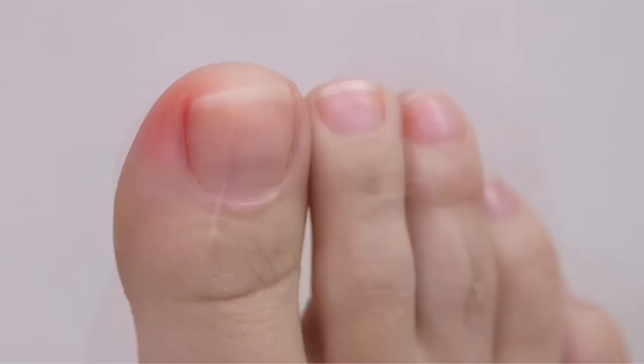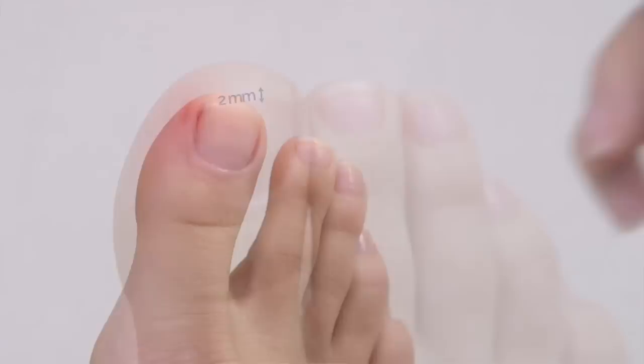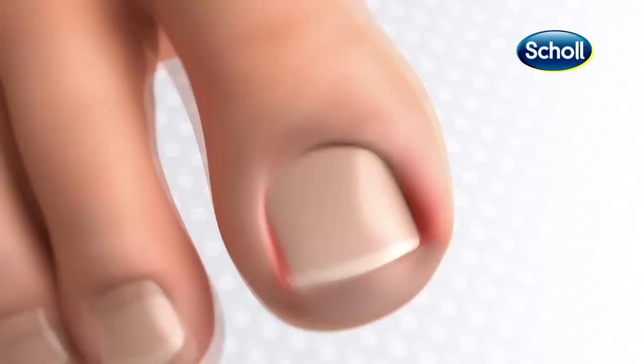Before putting the clip on, please make sure the nail is at least 2mm long. Start by applying a thin layer of the nail glue to the edge of the nail. Then apply the toenail straightening clip to the edge of the nail.